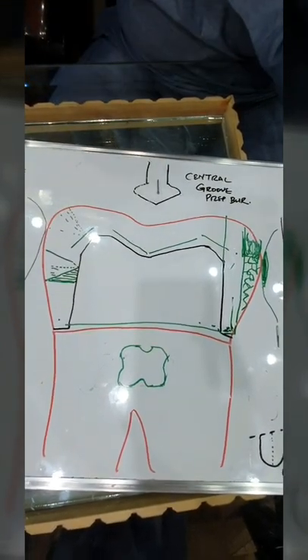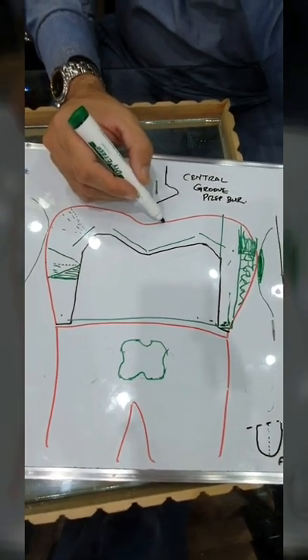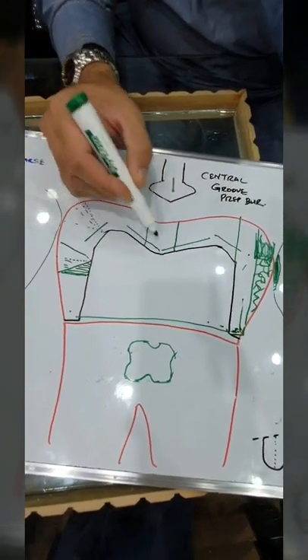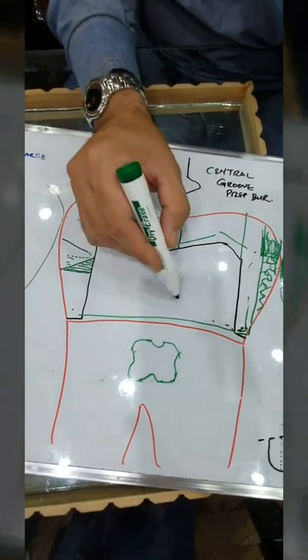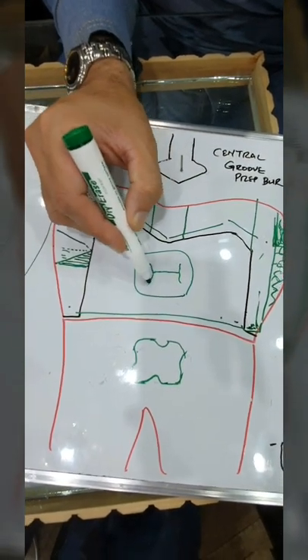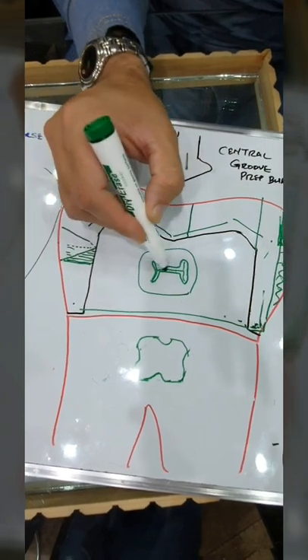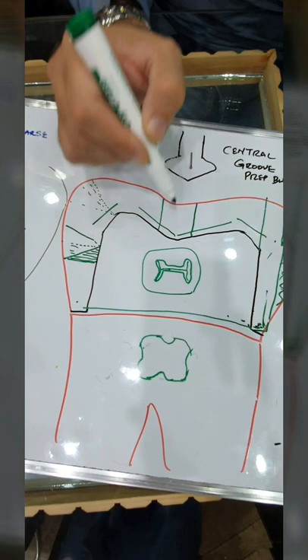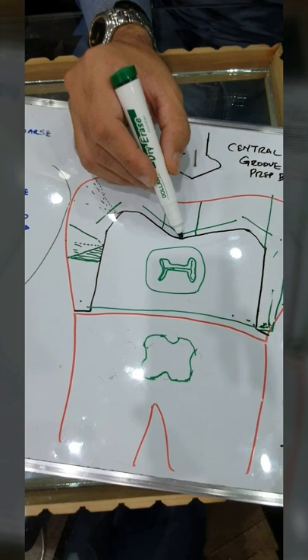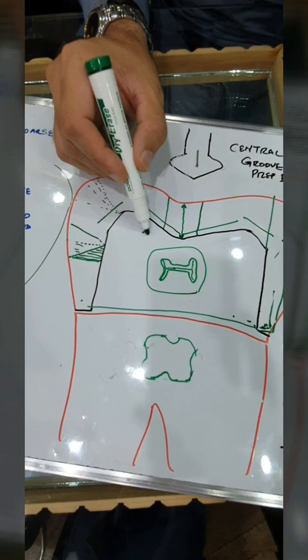In the beginning, it used to be hard for me to do this concept. So what I started doing in the beginning was I would take a regular composite or amalgam prep burr, and I would do a class 1 preparation on the occlusion in the central groove. So if this was a tooth and it has grooves like this, I would do a class 1 prep like this all around. Then I would connect the cusp to that. But once I found this burr, it was kind of nice, and now I can go ahead and sink that in and get my required depth. At the functional areas, the required depth could be 2 millimeters.